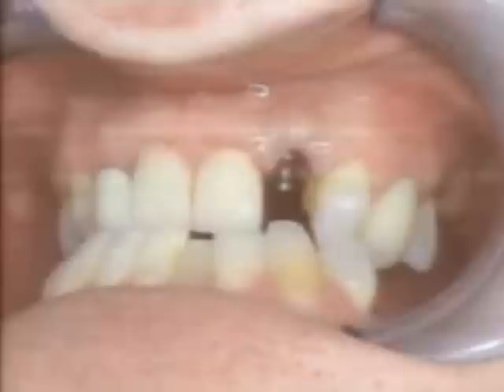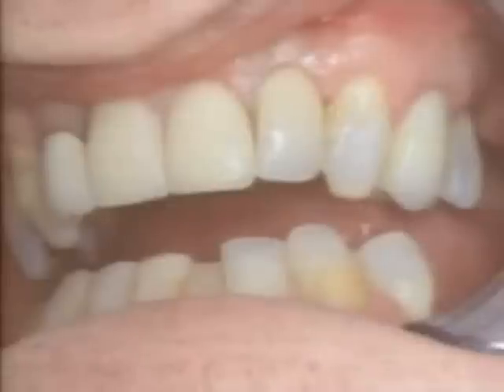All right, here's one. This is a gentleman, I think, who is missing a lateral incisor, which is a very common tooth to be missing. In this case, it was knocked out in an injury, but many times people are congenitally missing lateral incisors, and they have to wear removable retainers. And here we replaced it with an implant. You can take a look at the next picture. And here's the space where the tooth was, the little mini implant in place in the gum. And then there's the tooth replaced right at the same time as the placement of the implant.